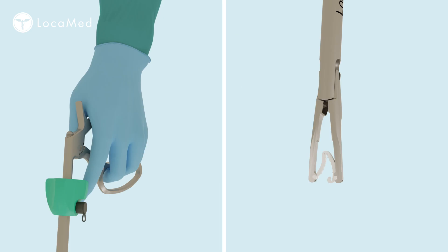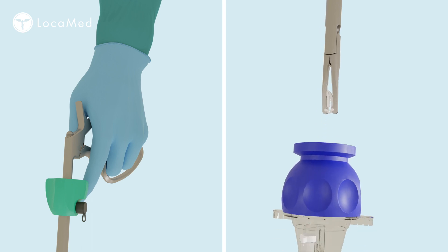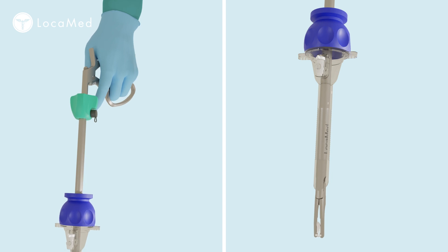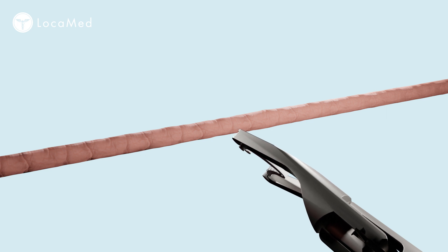Close the handle slightly to manipulate the clip down into and through the trocar cannula, maintaining compression on the handle until the applier jaws pass through the cannula and into the abdominal cavity. Confirm that the clip remains properly located within the jaws before deployment.